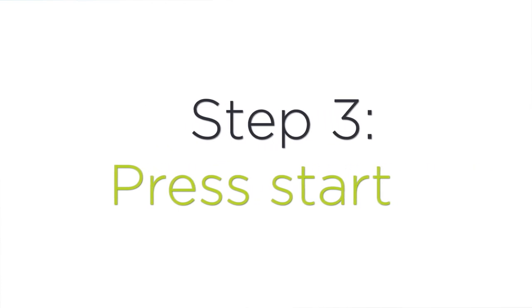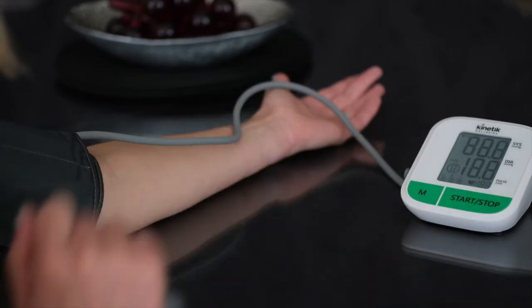Step three: press start. Don't talk and relax as the cuff inflates.